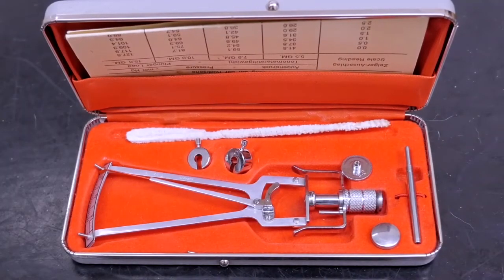The Schiotz tonometer should be disassembled and cleaned after each usage to ensure that it is free from debris, which can inhibit plunger movement.